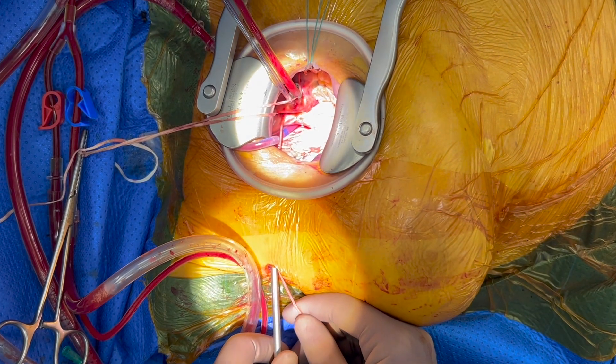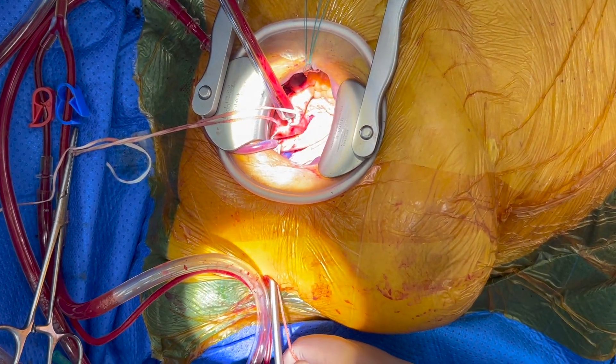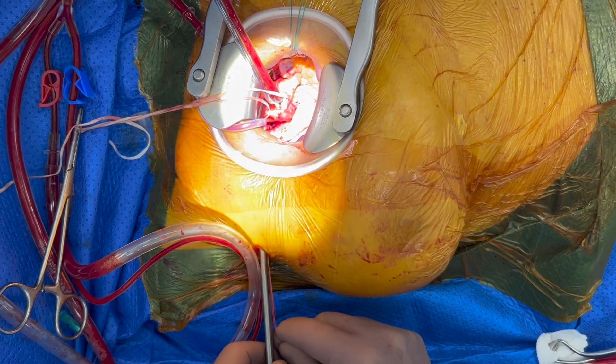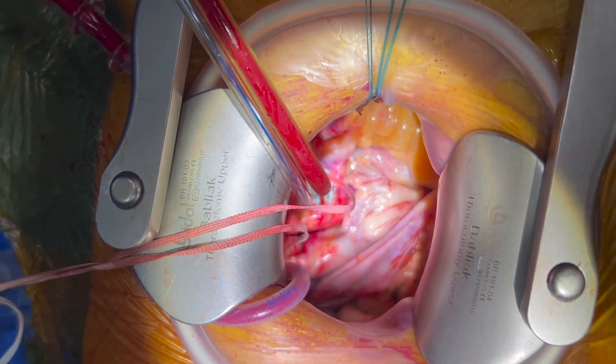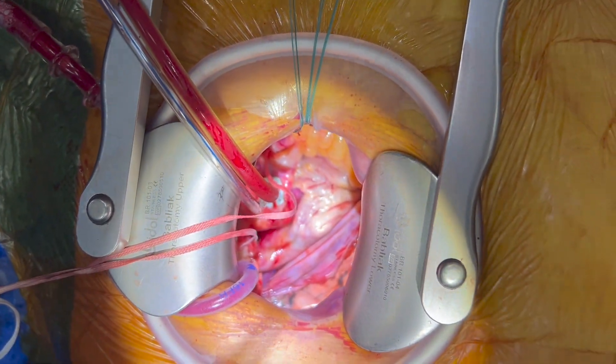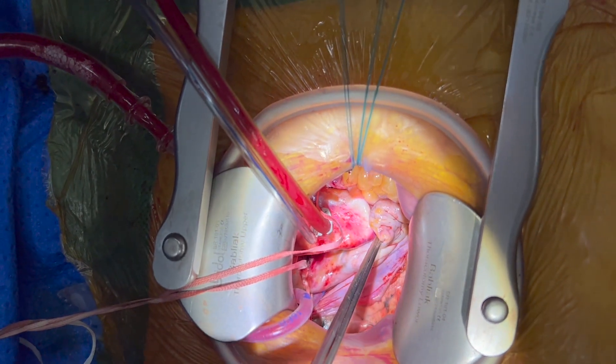To do this, we put the tape around the superior vena cava and take it through the Chitwood side. By pulling the SVC tape, the surgeon moves all the mediastinum to the right, which brings the aortic valve into the middle of the operation wound.